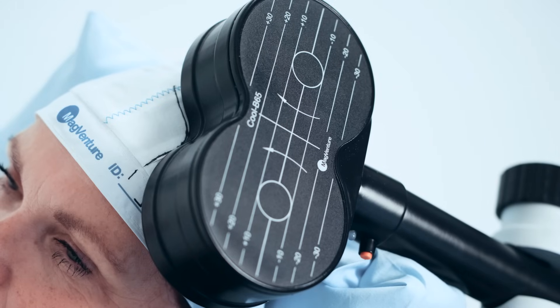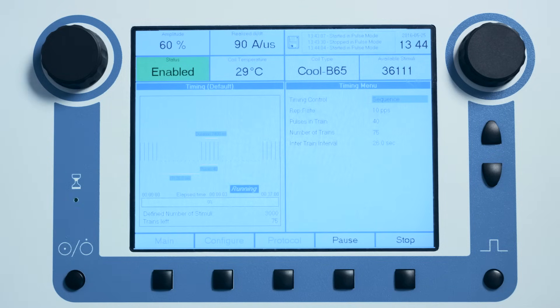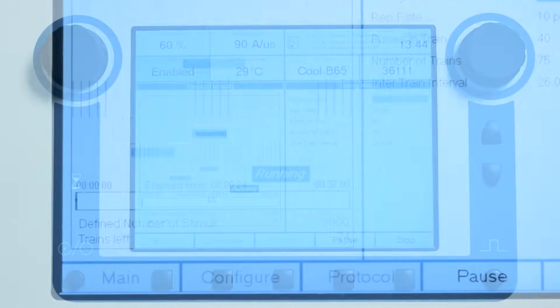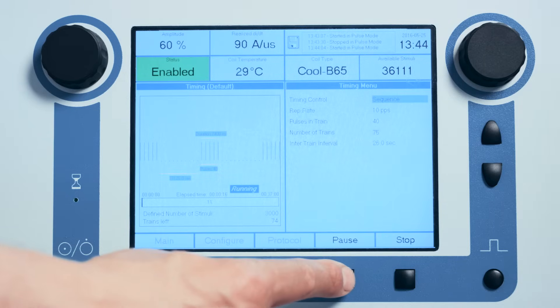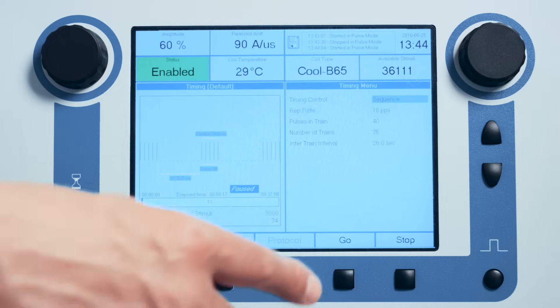Once the RTMS treatment session has been initiated, the graphic display in the lower left part of the timing menu is populated with information about the protocol. The total time and number of pulses in the protocol is shown, as well as a progress bar that indicates how much of the protocol has been delivered and how much remains before completion. During the treatment, it is possible to pause the protocol and resume from the point of pause using the pause button.